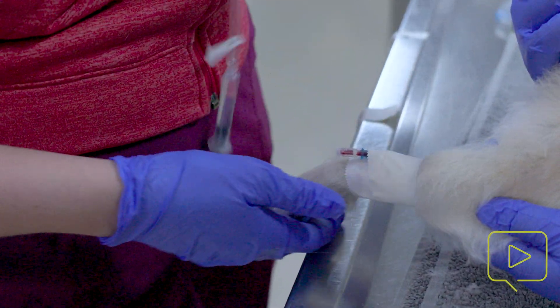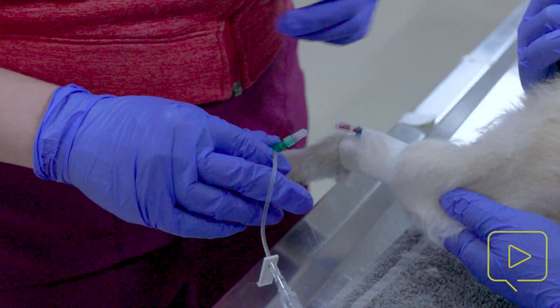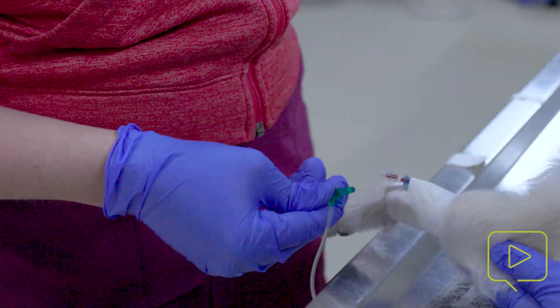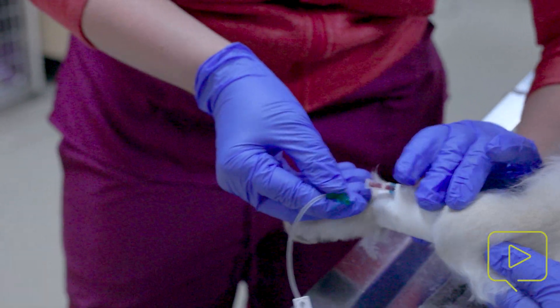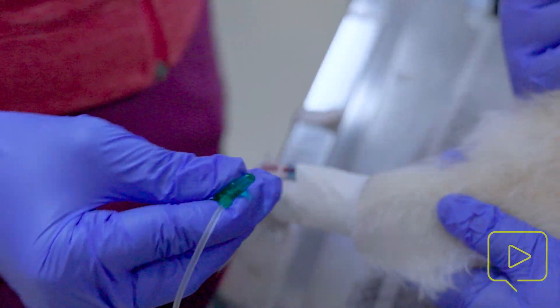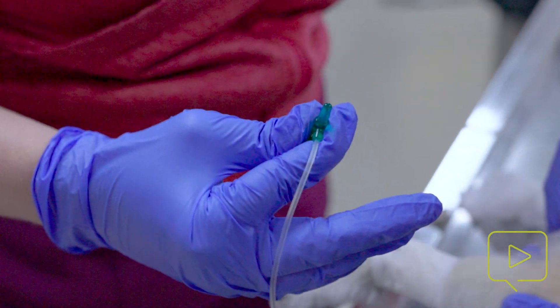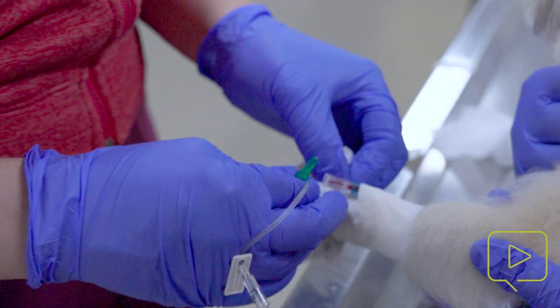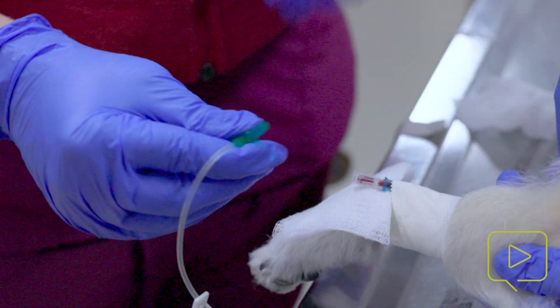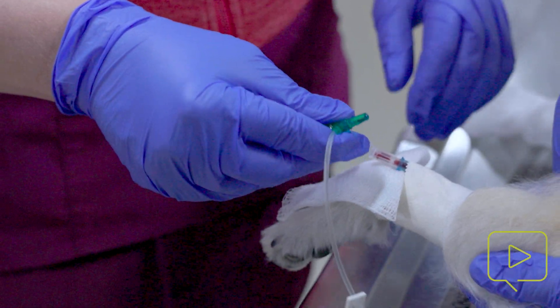Now that I have my first two pieces on, I'm going to place the T port on. This one already has a syringe attached; we make sure to pre-flush it. I'm going to take this plastic piece off and hold off the vessel right here to try to stop it from bleeding. For larger dogs, I like to wedge a piece of gauze up underneath the IV catheter so it catches any blood that drips down onto the gauze versus the tape, because we want to keep that as clean as possible to reduce issues with bacteria and infections.